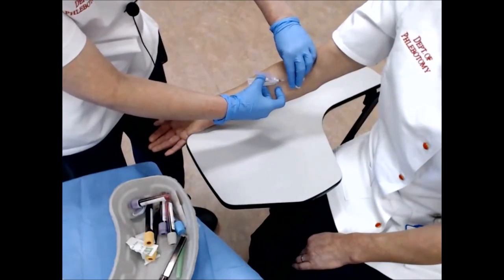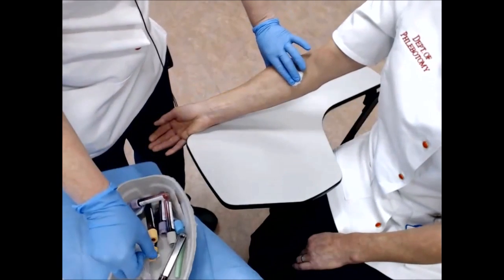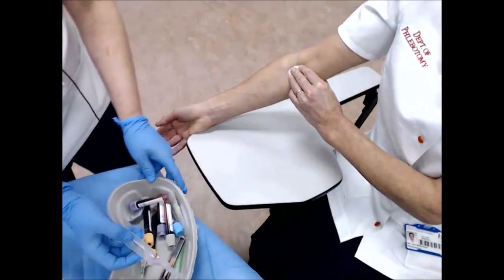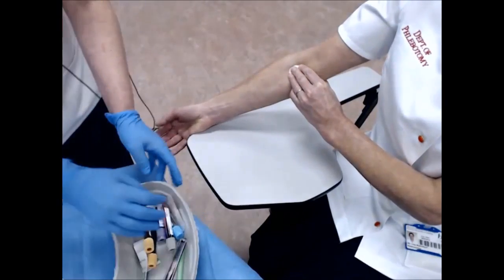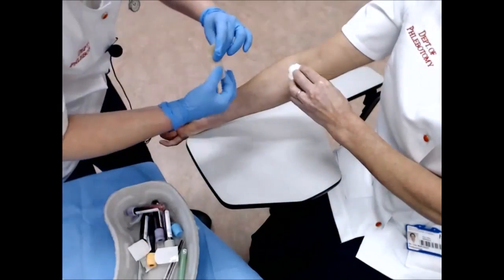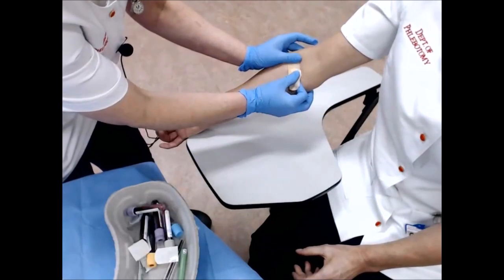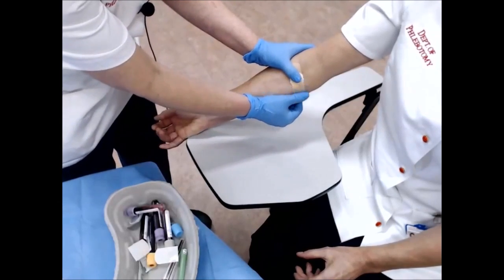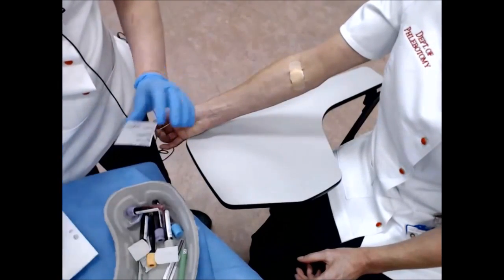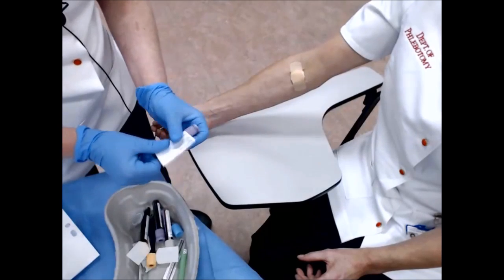I then cover the site with cotton wool, retract the needle, close the safety, and have the patient push down on the cotton wool. I discard the needle into the sharps container, apply a plaster, and then label the tubes by the patient, ensuring that the labels do not go over the top or the bottom of the bottle, but just around the center.